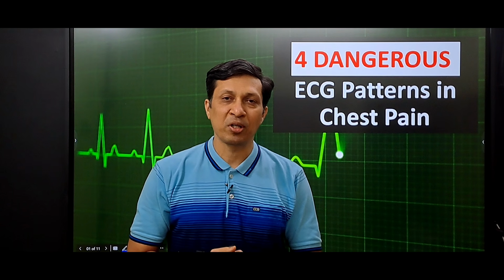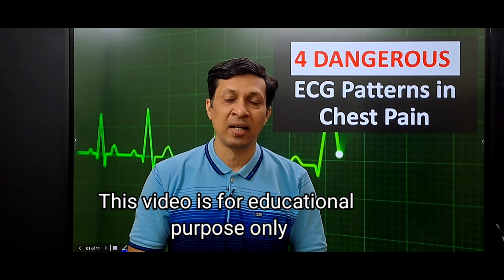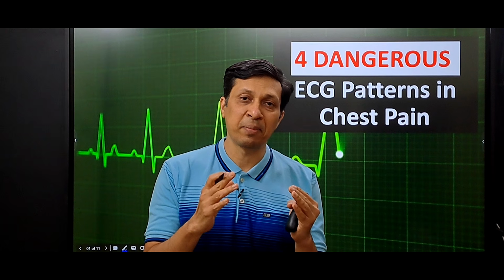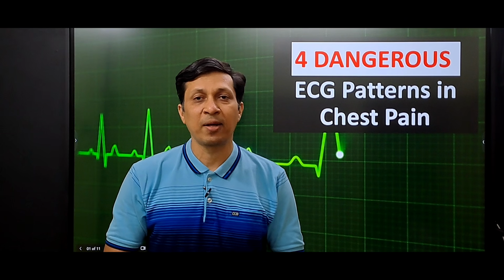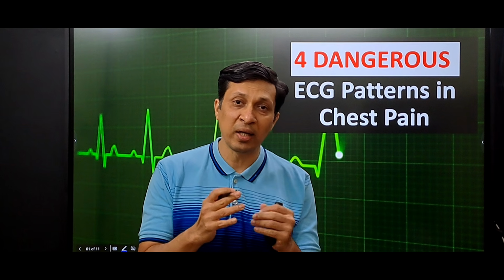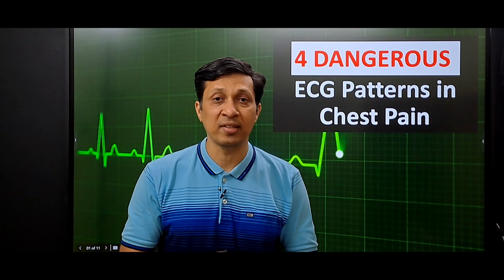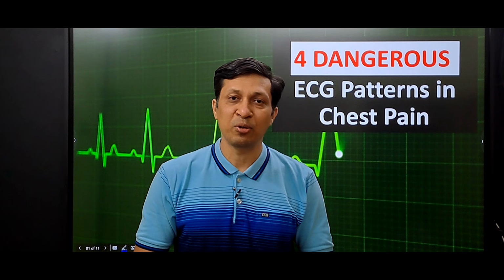Hi, I am Dr. Saurabh and today I am going to decode 4 such ECG patterns that are very critical in patients presenting with chest pain. These are the patterns that every young doctor must be able to identify quickly, because sometimes these may be the only warning signs before the disaster strikes. So let's dive straight into it.